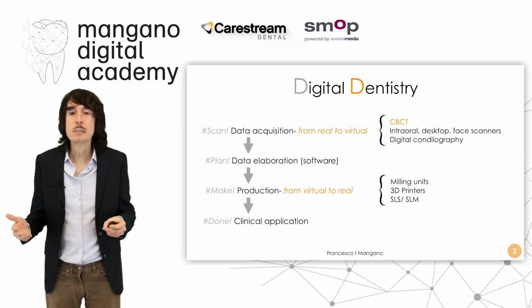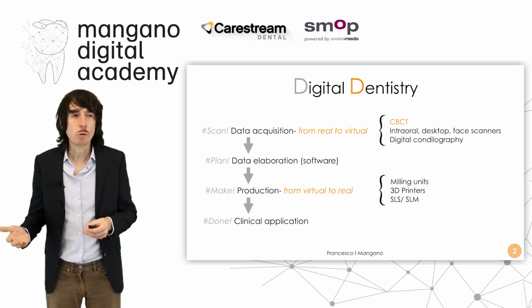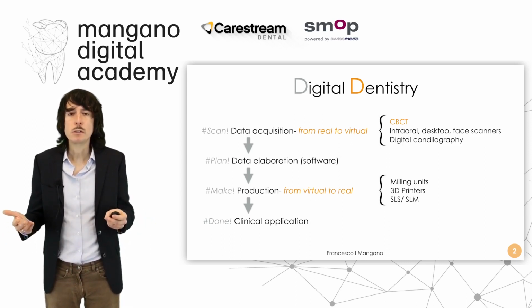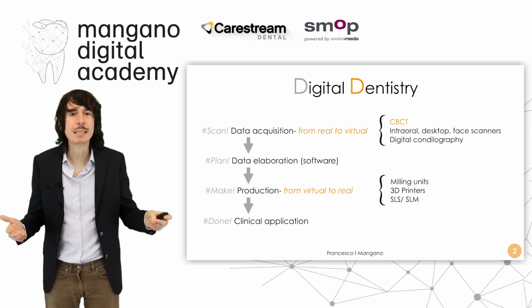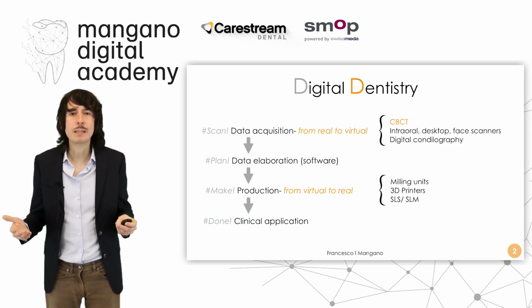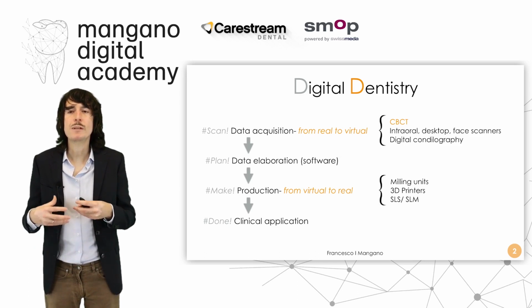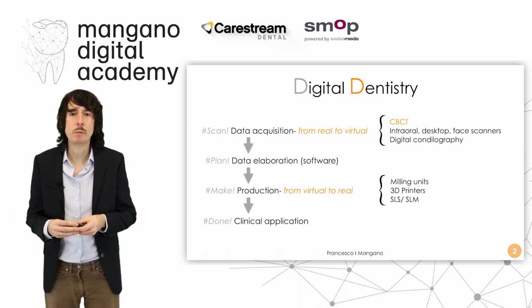We have computer-assisted design software for prosthodontics, for orthodontics, for surgery, and we need to use this software having proper data to manage. The data given by cone beam computed tomography, intraoral scanner, face scanner, digital condylography can all be composed together in order to create our virtual patient.